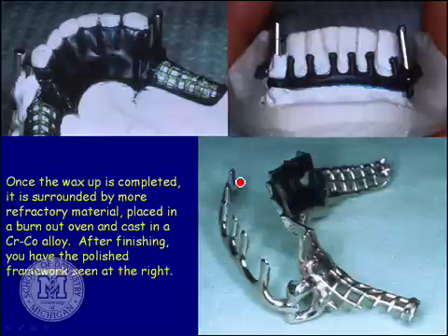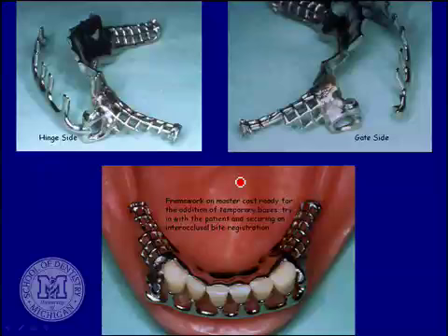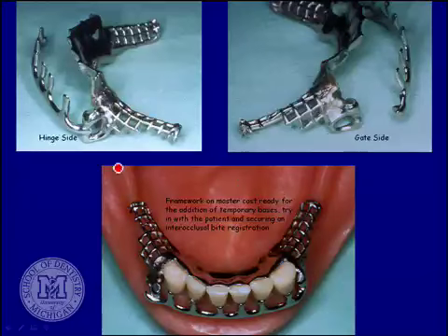On the other side, the waxing wraps around part of this spindle, but it doesn't go all the way around. Then when it's cast, there's just enough surface contamination on these that it will allow these things to open up and swing. It's not a problem. And so basically, here's your hinge side, so you can see when the waxing was done here, unlike the hinge side, on the other side, this waxing didn't wrap all the way around this spindle.